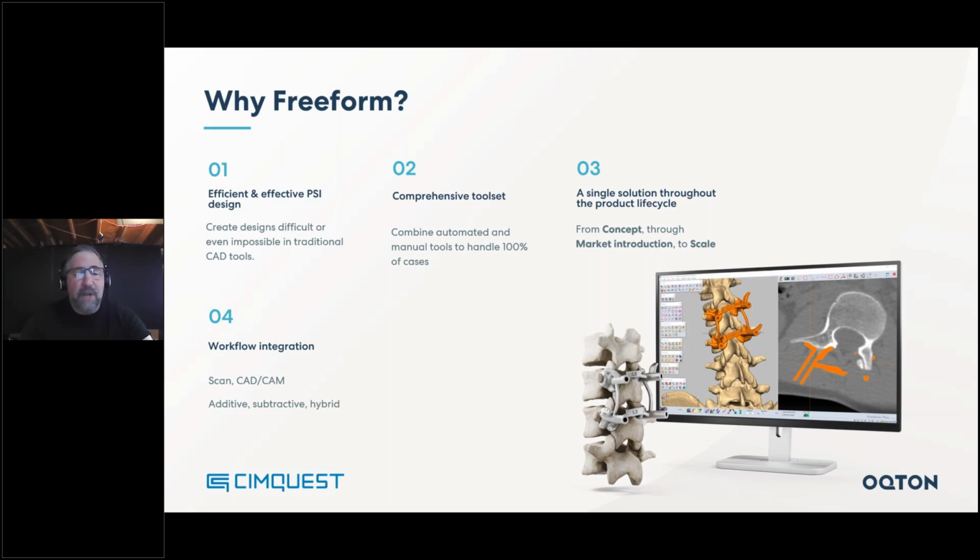We accept data from all types of scanners. You can import CAD data. You can import medical DICOM imaging into Freeform, and we work with all of it.